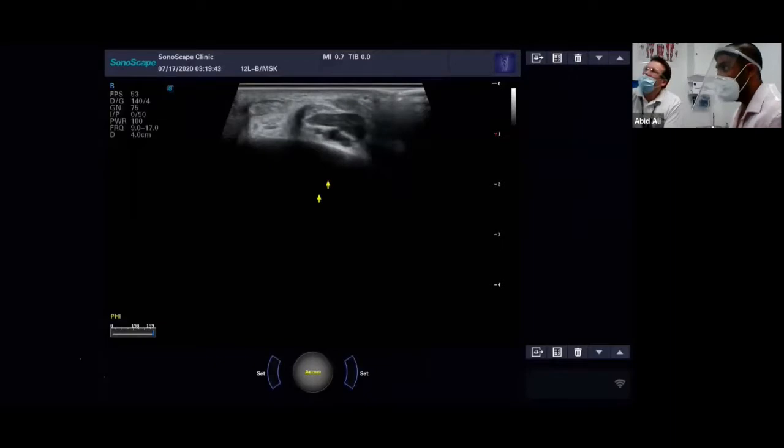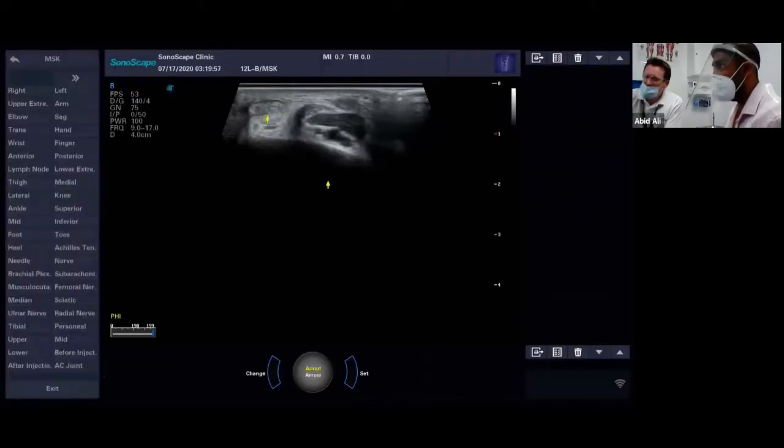Oops. So on the left of the screen, sorry, your left, that's your tibialis anterior. It's a nice big chunky tendon. Nice shape, slightly oval at this point, and then it becomes slightly more cylindrical a little bit further down, and then it goes oval again as we go down the dorsum of the foot. Then we have the Extensor Hallucis longus tendon just in view there. Adrian's marking it out with his yellow marker.